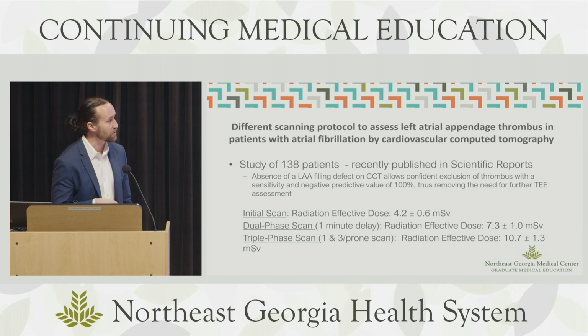In this study of 138 patients, using the delayed protocols, there were 3 different studies a part of it, one used a dual phase and a triple phase. They were able to successfully exclude and identify, when comparing with TEE, that all these patients with filling defects except for one did have left atrial appendage thrombus. So that would be the limitation in cardiac CT: not ruling it out, but if there is some concern for thrombus, verifying and confirming that it actually is a thrombus.